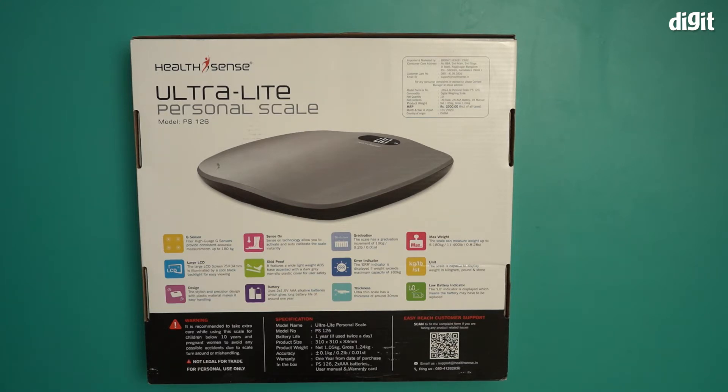This runs off batteries — it uses two 1.5 volt triple-A alkaline batteries. I'm assuming those should be inside the box, and we'll check once we open it up. The scale has a graduation increment of 100 grams or 0.2 lb. An error indicator is also present: the ERR indicator is displayed if weight exceeds the maximum capacity of 180 kgs.